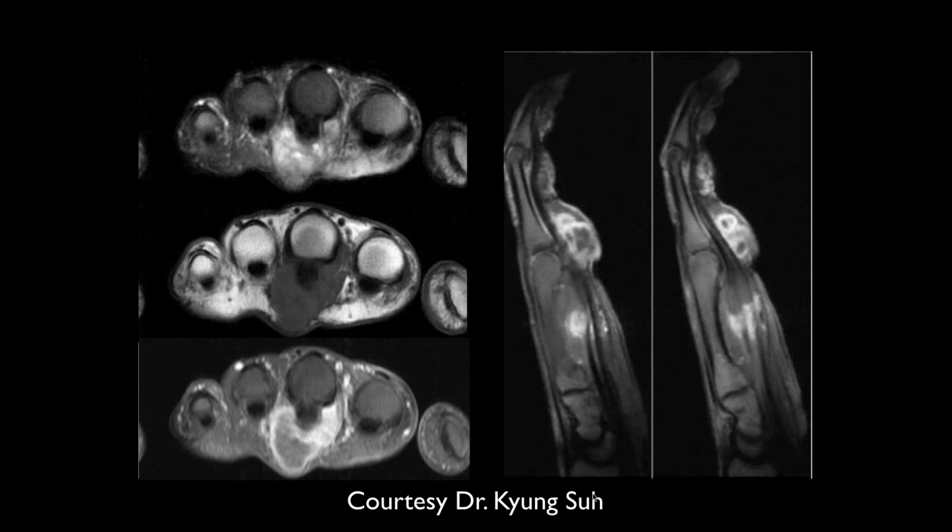Okay. It looks like this is the hand. We got three axial images of the hand and two sagittals. We got this kind of infiltrative mass along the palmar aspect of the third ray, which looks like on T1, which is the middle one, hypo to iso intense, and also enhancement peripherally, mostly on the post-contrast images.